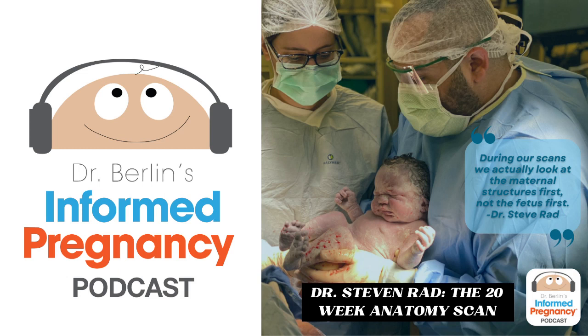Is the range of normal change from month to month? No, it's always 2. We always want it to be between 2 and 8. So there's both a quantitative and a subjective or qualitative. So you always want the deepest pocket to be between 2 and 8? Correct. And then what about the AFI the other way?